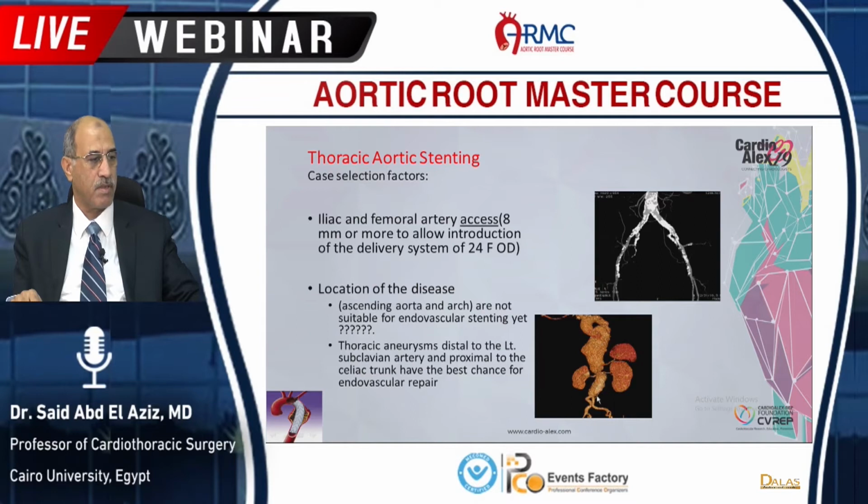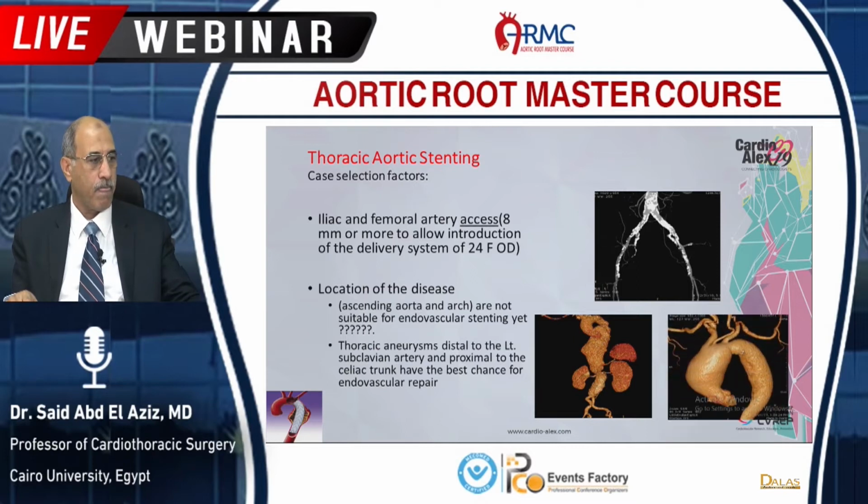You see this is not a candidate at all for thoracic stenting. The standard thoracic stenting, we can do that with the fenestrated grafts and branched grafts for the celiac and the mesenteric and renal arteries, but this is a sophisticated case. I am speaking about the simple standard stent graft. And this is ascending and the arch. This is also not a candidate for stenting.